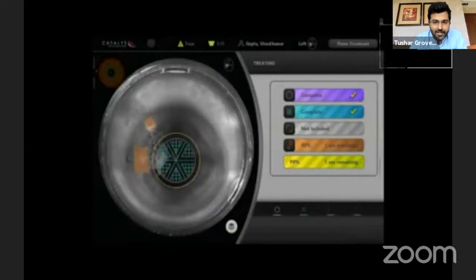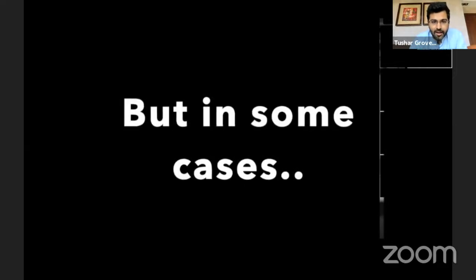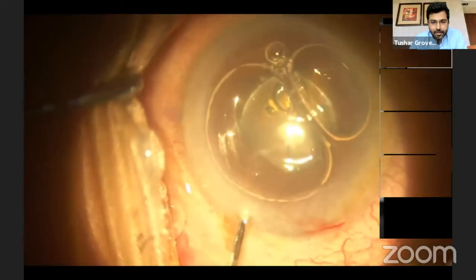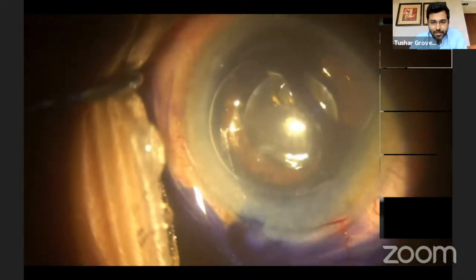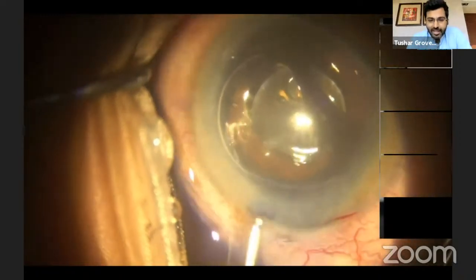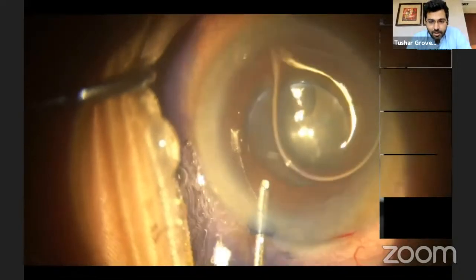But sometimes this can go wrong, such as in this case, where once we took up the patient for surgery, we noticed that there was some pigment dispersion, which is why we stained this particular patient. When you look at this case, it's quite evident that a part of the capsulotomy by the femtosecond laser has been done over the iris. So the energy has been delivered onto the iris, and quite evidently, there is an area of uncut capsulotomy.